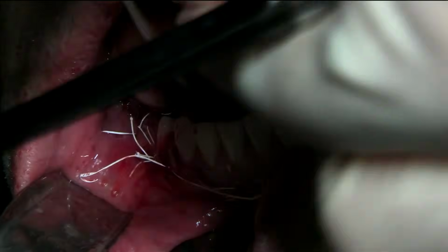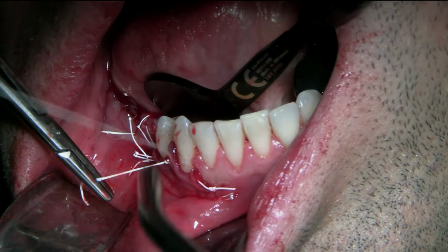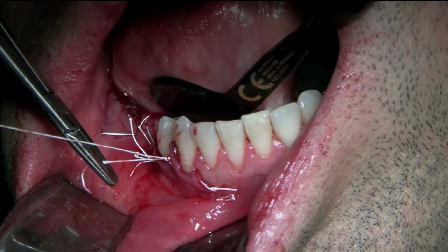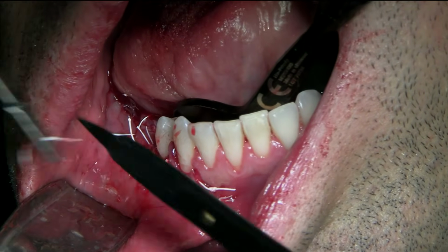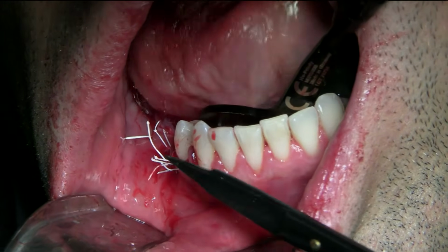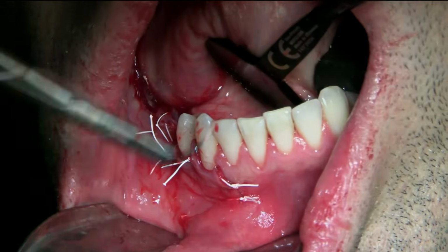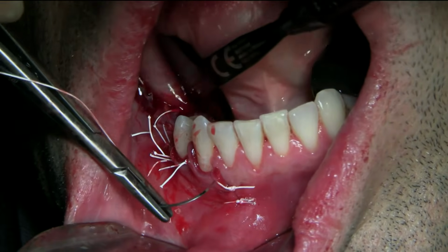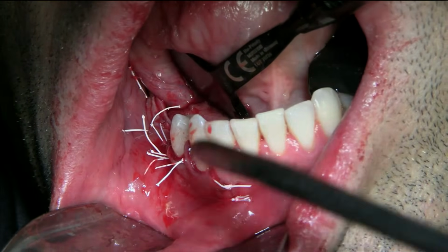Here's suction here. So basically, cold packs, ibuprofen, and Arnica montana. Those are the three main things. Okay, this is good. This maybe here. I need this papilla, and I need to secure this top papilla.